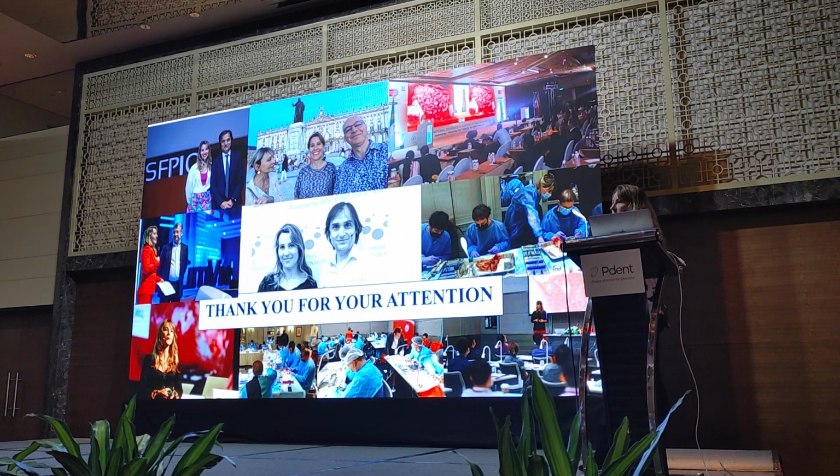Hỏi đi cho tụt xuống đây. Tụt cái miếng ấy cái giải lợi.